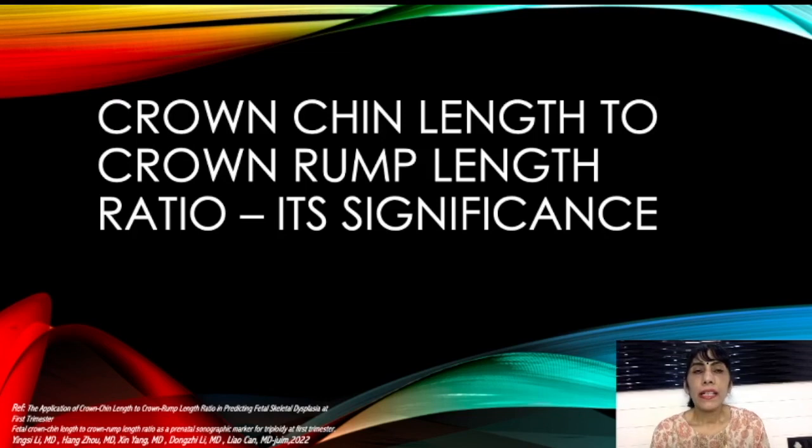So every other day, new things are coming up and being added to the NT-NB or the 11 to 14 weeks scan. This is another thing we can add on to this scan: the crown chin length to crown rump length ratio. It can be used as an early screening tool for chromosomal abnormalities and for skeletal dysplasias, and anencephaly also you can judge in early stages.